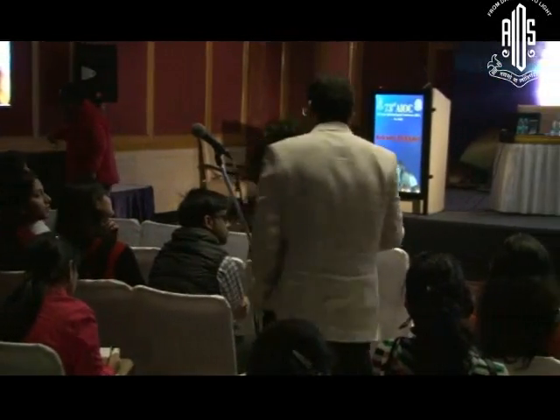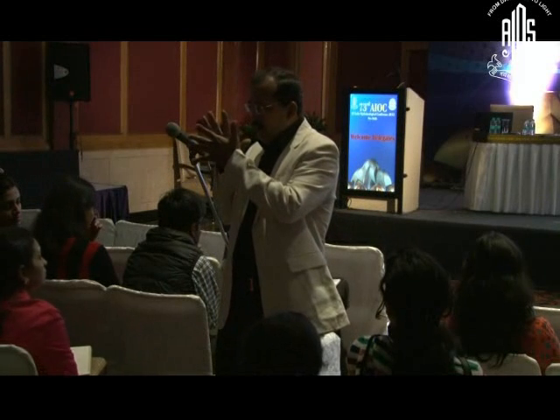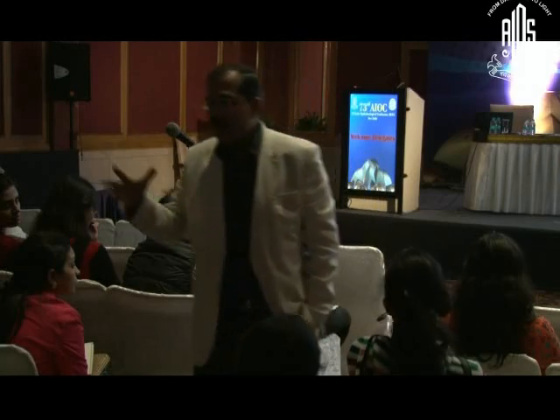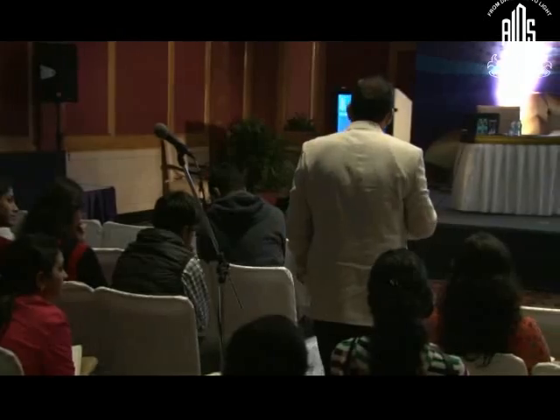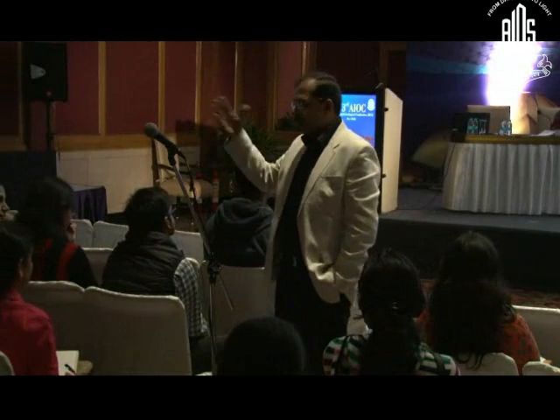There was an era where we were using biconvex lenses, where even the posterior surface was convex. If the posterior surface is convex, what will happen? Tell me. If I put a biconvex lens, with the posterior surface convex, the vitreous face, which is with silicone oil, will press against that, and what shape will it take? It will take a concave shape. A concave lens will be produced in the vitreous. Then what will be the effect? A concave lens in the vitreous will shift the eye towards hyperopia. So whatever lens you put, the patient will have a hyperopic shift.